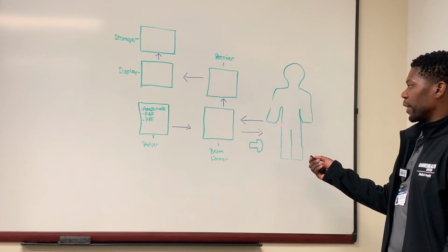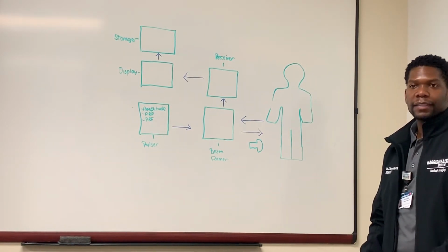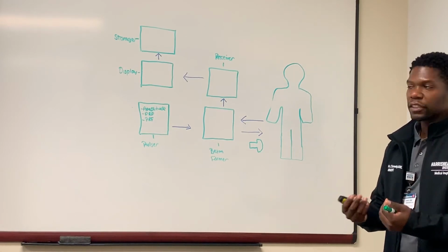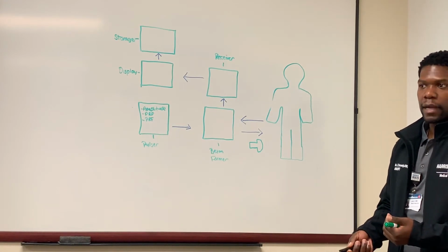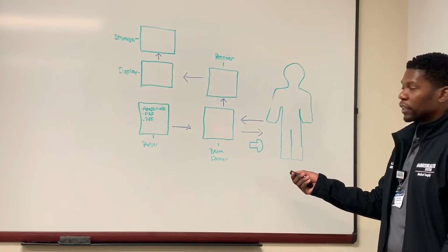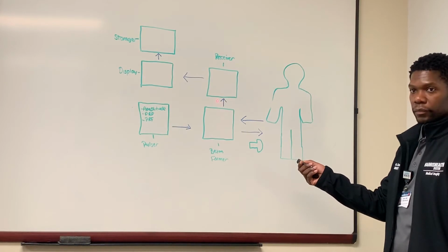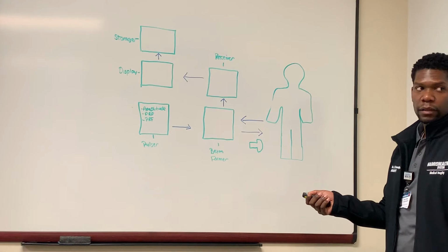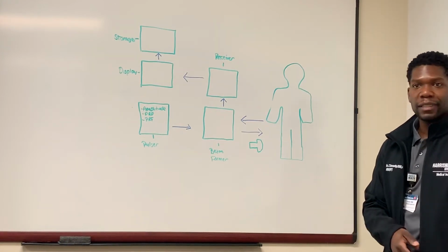So our signals are coming to the patient. Boom, they bounce off the patient. They're going to come back to the beamformer because the beamformer has to control the dynamic receive focusing, and it's going to control the aperture, the dynamic aperture too. After it comes back, those electrical signals are going to be sent to the receiver, which has 5 functions, and we're going to talk about the receiver in a minute. The beamformer works during both transmission and reception.